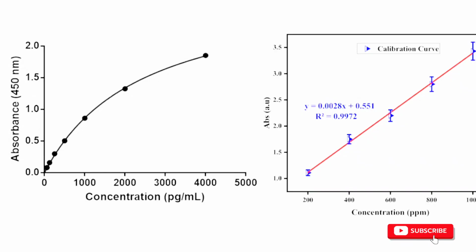So what I'm trying to explain here is that when we look at linearity, it covers the low aspect, the normal aspect, and the higher aspect. It covers low abnormal, normal, and high abnormal as well. But what happens if you get a result that is drastically high, outside its comfort zone? It cannot give you a result. If it does give you a result, it will tell you that this is outside linearity, and then you have to do something about it.